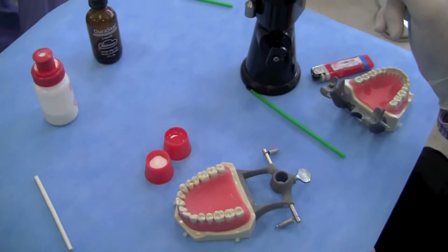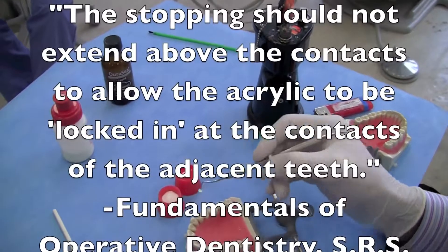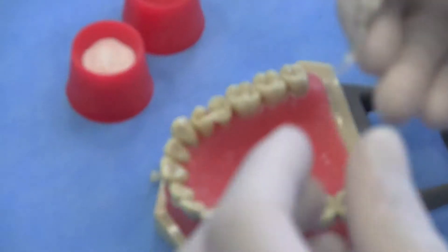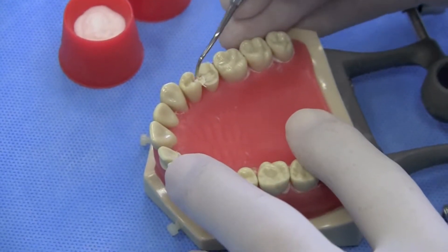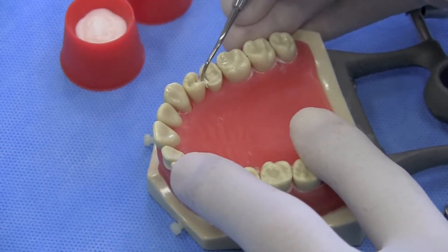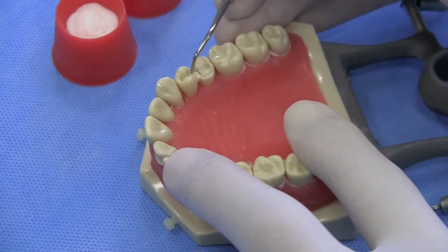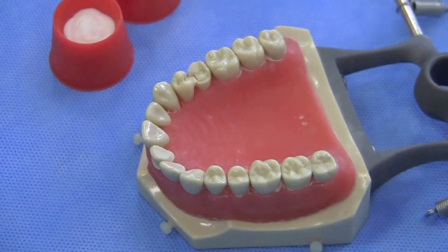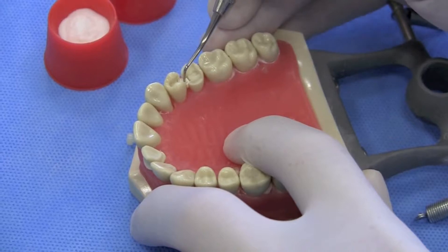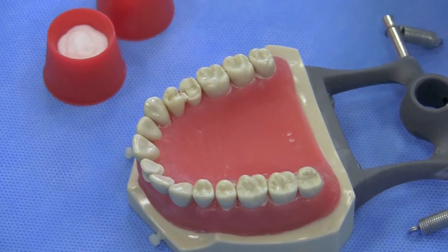Warm the Gutta Percha slightly over a flame until it becomes soft, then insert the product into the box area with gentle pressure. You don't want to push too hard — if you push too hard, you may impart a little orthodontic movement in the teeth and have difficulties with contact management at the time of delivery of the prosthesis. Just a slight indentation. Some clinicians also place a small dimple to help retain the Duraceal material on top.